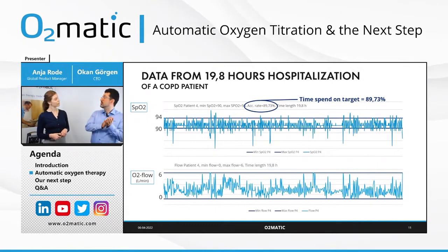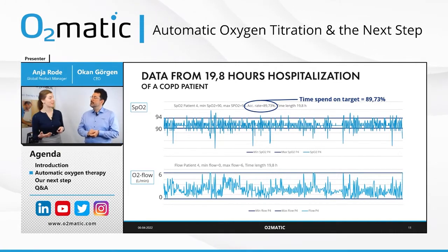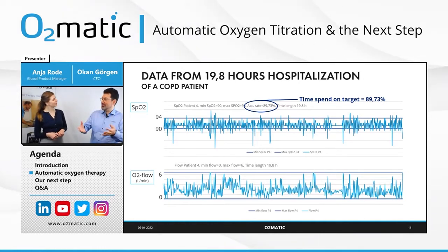And you also need some time for the device to find the right amount for the patient. We can't predict the patient yet. No, so, and the patient is hopefully moving around and being active, and that's why sometimes the oxygen saturation can drop. And my best guess will also be that some of the deeper drops is actually loss of signal from the pulse oximeter. And then again, a question for you: seeing this, and now that you know that you could only keep it 47% of the time, are you then surprised?